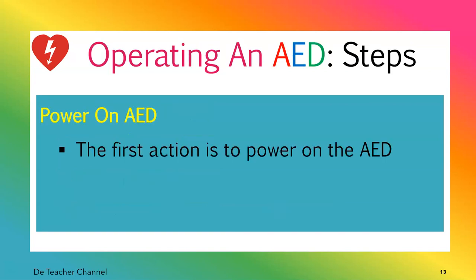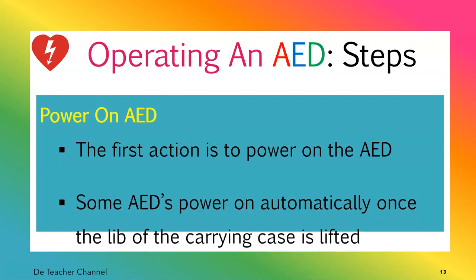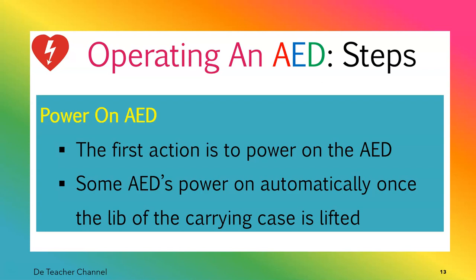Alright, power it on. The first action is to power it on. Power on the AED. Some AEDs power on automatically. So some AEDs can power on automatically once the lid or the carrying case is lifted.